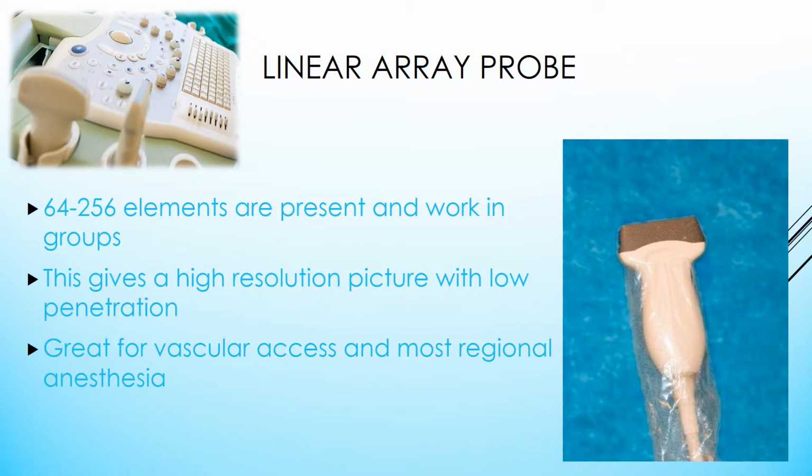In the linear array probe, 64 to 256 elements are present and work in groups. This gives a high-resolution picture with low penetration. This is great for vascular access and most regional anesthesia.